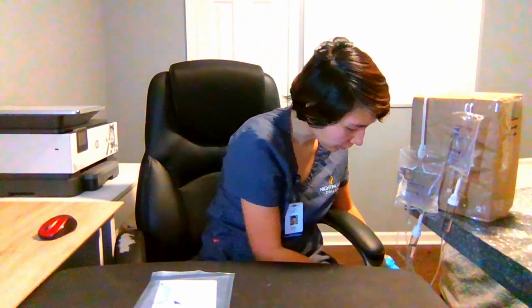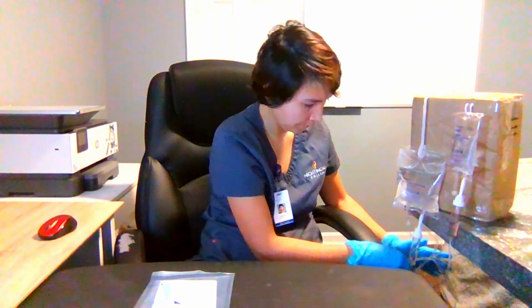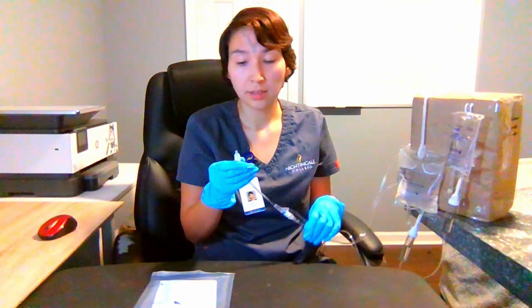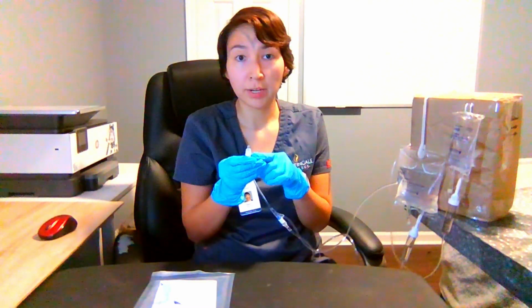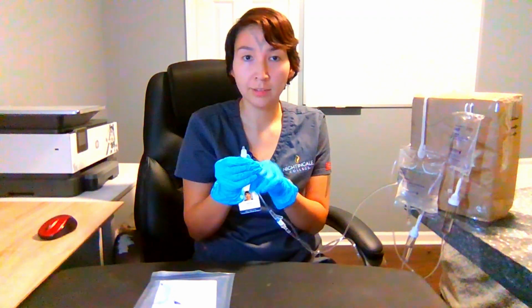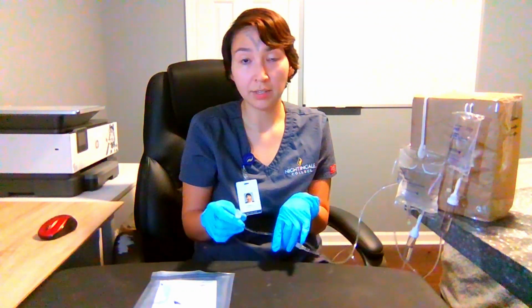After ensuring that the medication fluid drop rate is 100 drops per minute and the IV fluid flow rate is 38 drops per minute, I can now connect the primary adapter from the primary tubing to the patient's IV catheter.